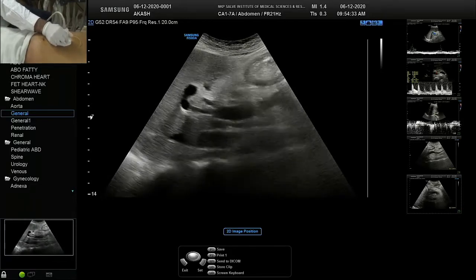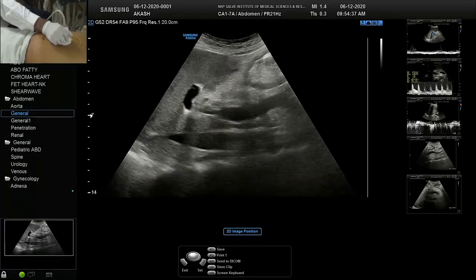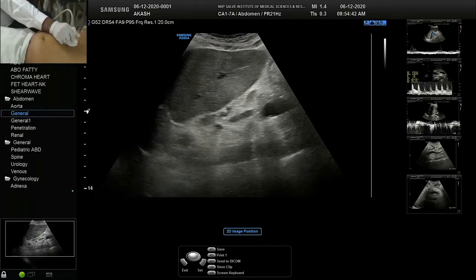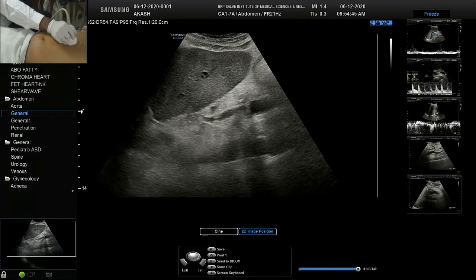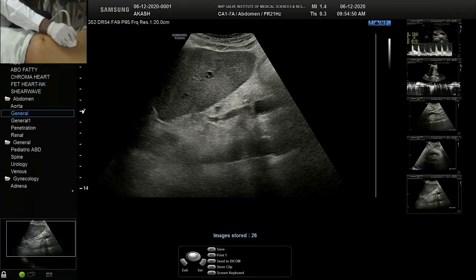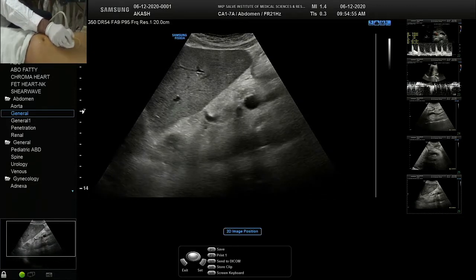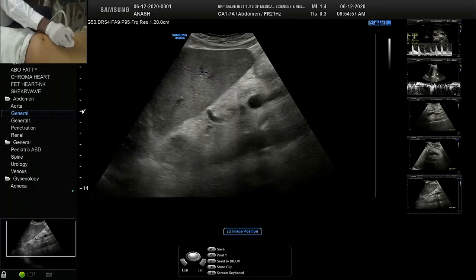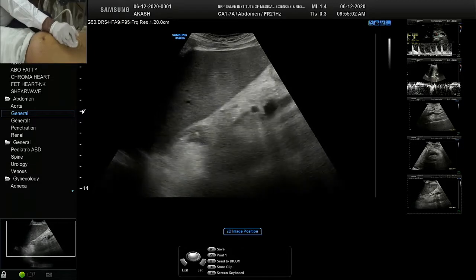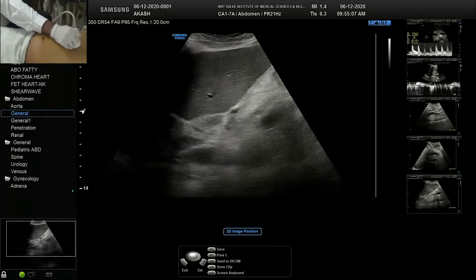And what is this? This is a big coronary vein. Sorry, I'll see with the pointer. See this. This is a coronary vein. We measure this. This is almost 8 millimeters. I think everybody can appreciate this. We had seen the same vein in the earlier patient. It was smaller diameter. It is a bigger diameter there, and you can see it is moving towards the esophageal GE junction. That's the GE junction there.